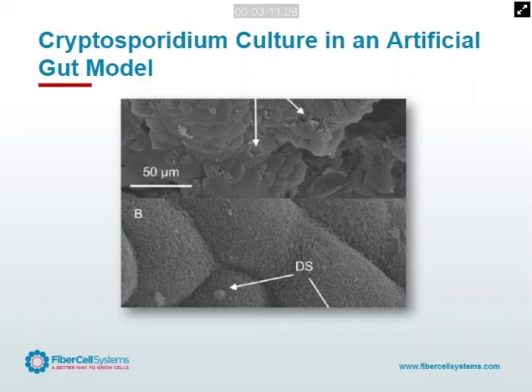And it took a special lipid package and a few other things, but they were actually able to take Cryptosporidium out of an animal, have it go through all its stages of development inside the cartridge, and then reinfect an animal. They'd never been able to do that before.